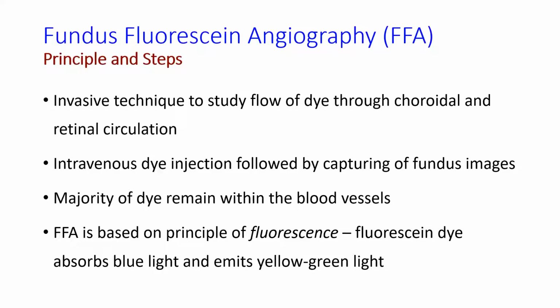Fundus fluorescein angiography is based on the principle of fluorescence, wherein the fluorescein dye absorbs the short wavelength blue light and emits the long wavelength yellow-green light.